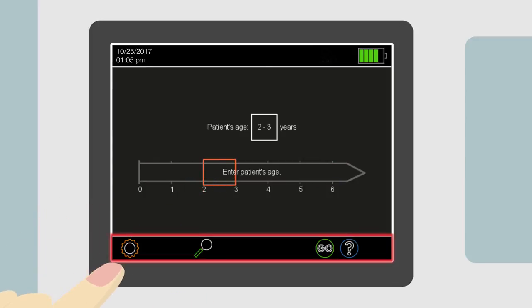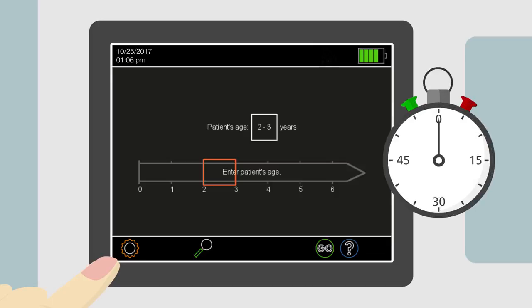The navigation bar contains the Settings button in the bottom left corner and a magnifier to the right. Touching the Settings button will display the settings page, while touching the magnifier leads to a page to enter patient data. The internal patient database is only available in the plusoptiX S12C model.